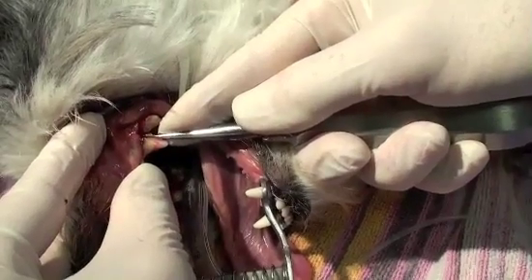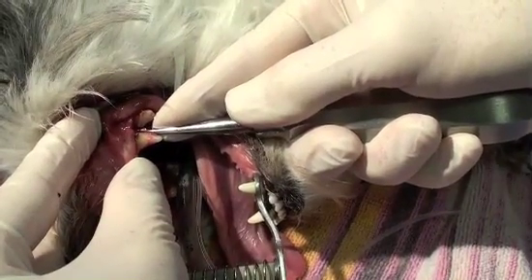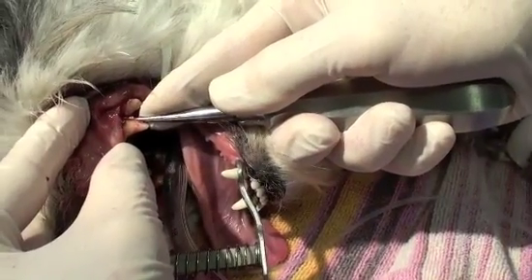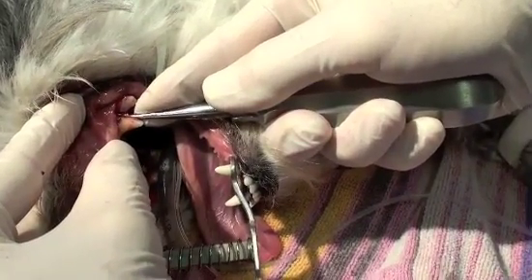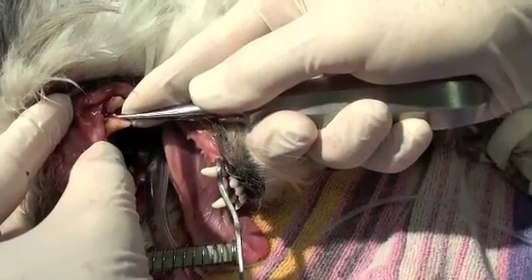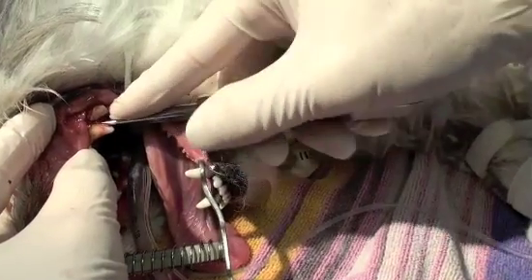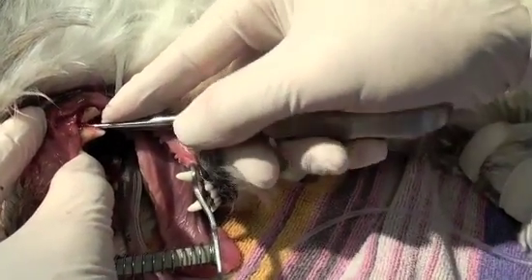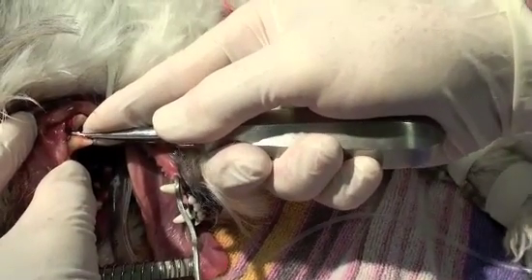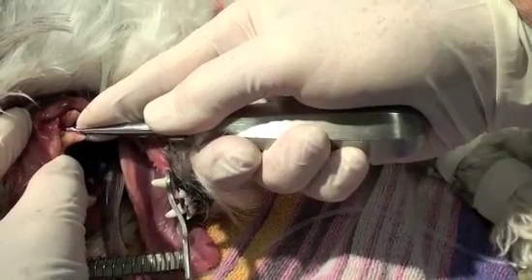What we're doing now is stressing the periodontal ligaments, and you just hold them in a stressed manner for up to 90 seconds and loosen the tooth in the tooth socket. If you just wiggle it madly, you will not break down the ligament. The tooth's designed every time you chew on something hard to put stress on the ligament. So if we rotate that backwards and forwards, we're actually not creating any long-term stress on the ligament. So stress the ligament, hold it there in a stress position for a while, and the tooth will generally make its way loose.